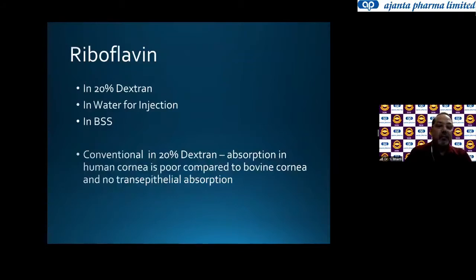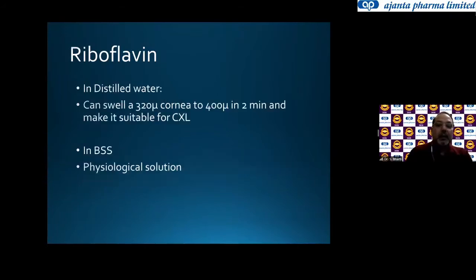And then in BSS or in water for riboflavin, if there's a riboflavin water, that can give you a good swelling of the cornea, by putting 1 or 2 drops of distilled water, and then you can do the thin cornea treatment with Dr.